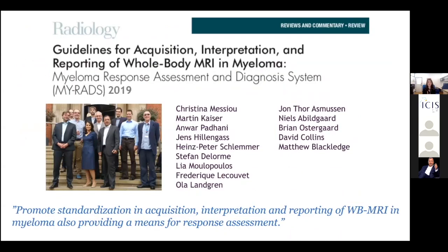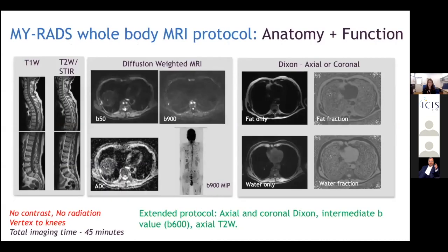So with whole body MRI firmly embedded in guidance, a number of us recognise the need to standardise acquisition, and this is MY-RADS. So this was a truly multidisciplinary group of radiologists, MRI physicists and haematologists who had come from centres experienced in offering a whole body MRI service for patients with myeloma. And this is the core protocol. It's a 45-minute protocol with scanning from vertex to knees with no intravenous contrast.